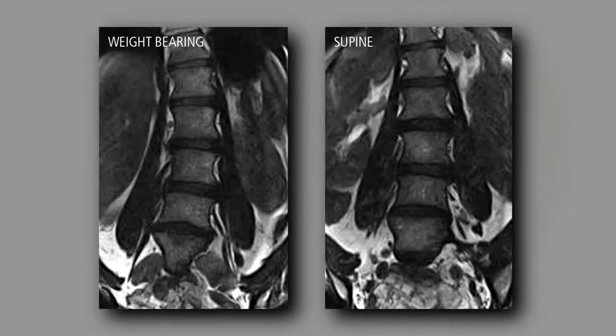The weight-bearing MR scanner allows patients to be examined under load-bearing conditions. We already know that we have picked up pathology on the same patient, having been scanned supine and then scanned in an erect position.